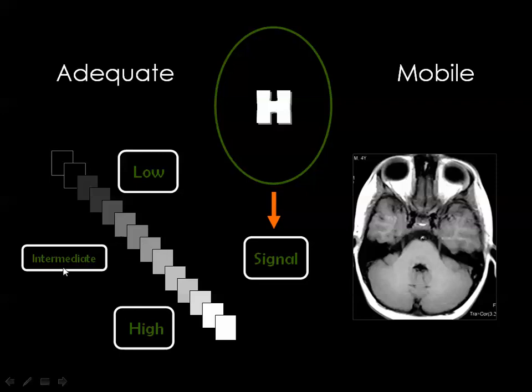And also you may say hypointense, hyperintense, isointense, and also you may call dark, bright, and gray. But the usual wording in MRI reports is low signal, high signal, and intermediate signal.